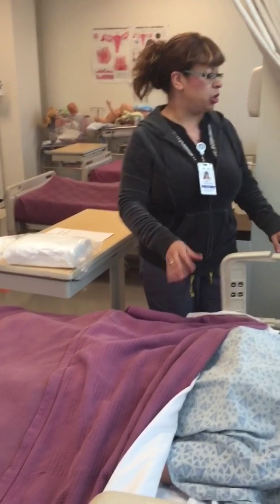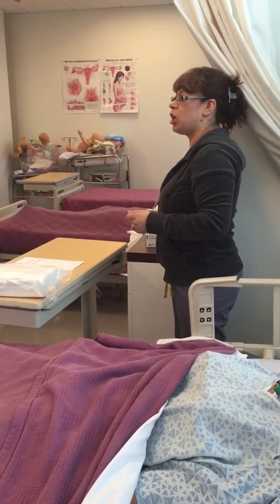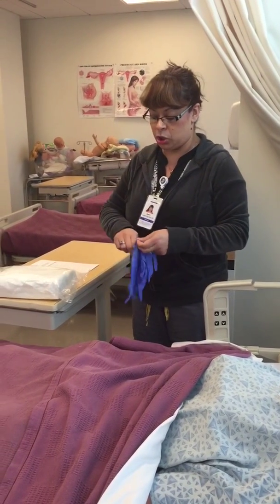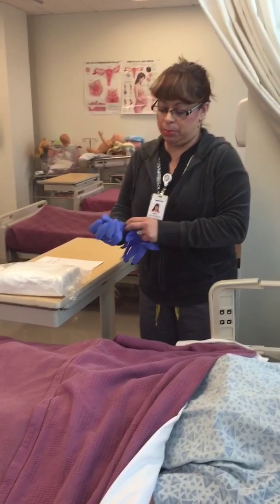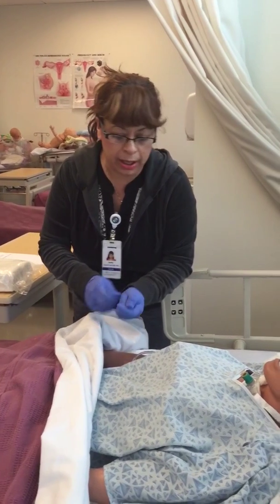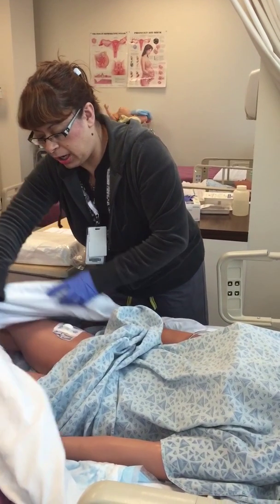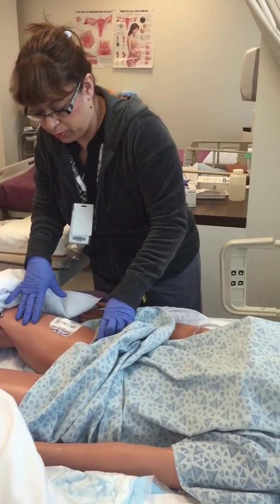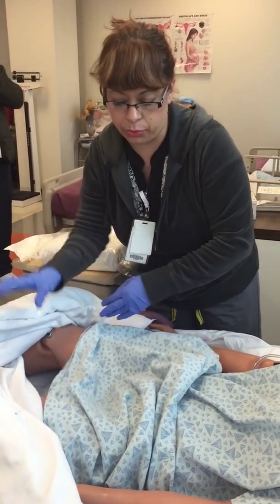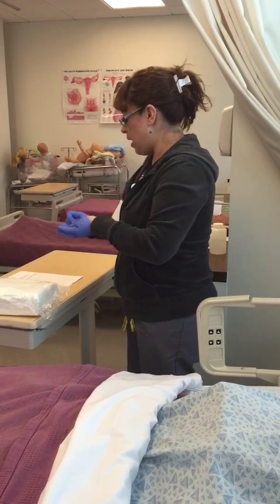Since I've been touching her, I'm going to hand sanitize again. Sanitize my hands, put on a set of gloves, because I'm going to check her peri area. I want to make sure first that she has a clean peri area before we start this procedure. So I'm going to put my gloves on. I'm going to expose you, okay? But I'll only expose the areas that I need to. So I'm going to check here, and it looks like she's clean, so I don't need to provide any peri care, but if it was dirty, then of course we want to provide that care first. So now that we established that, I'm going to go ahead and take my gloves off.